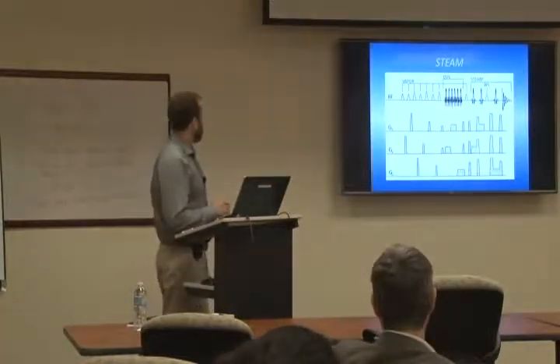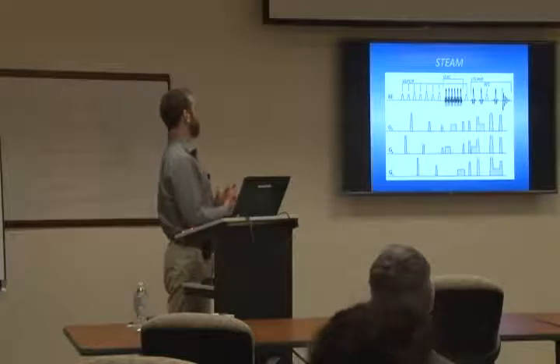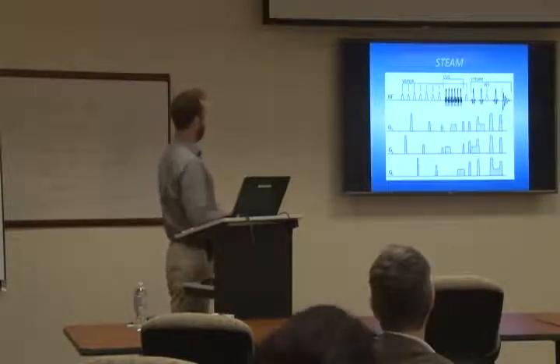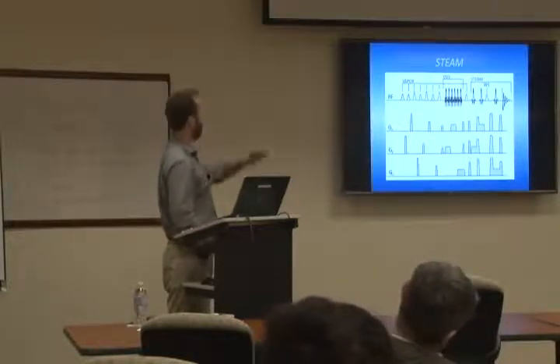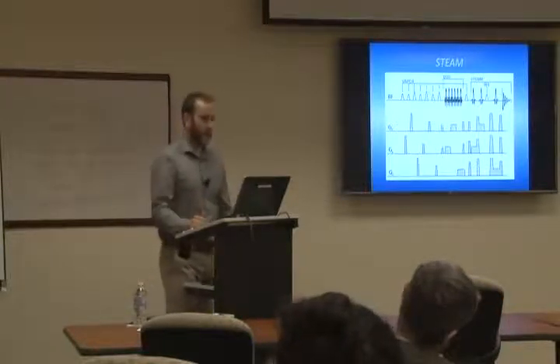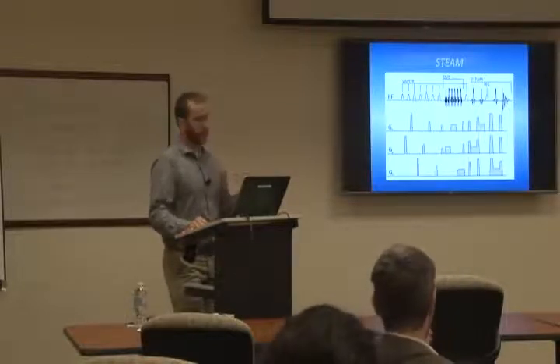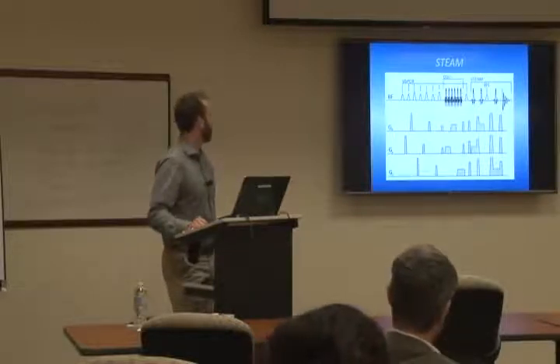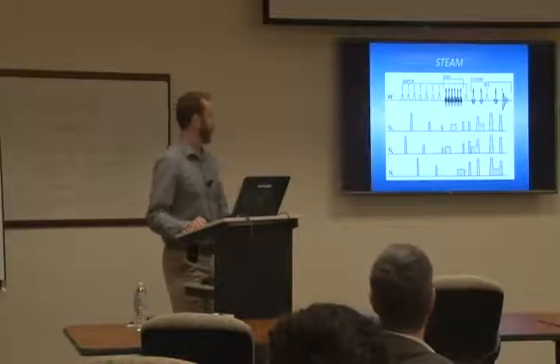And this is the sequence that I spent most of my time developing. It's based off of a sequence in Minnesota. I don't expect you to follow any of this. The top line is the RF waves you're sending, and then the bottom 3 are the 3 different gradient axes. I just put that up there so you can see that when you're requesting a new sequence, it could just be the addition of one extra pulse or a couple different gradient patterns in there that can make all the difference in your sequence.